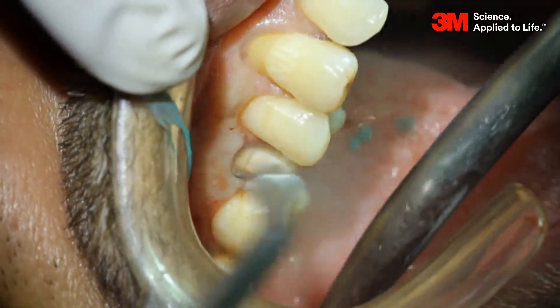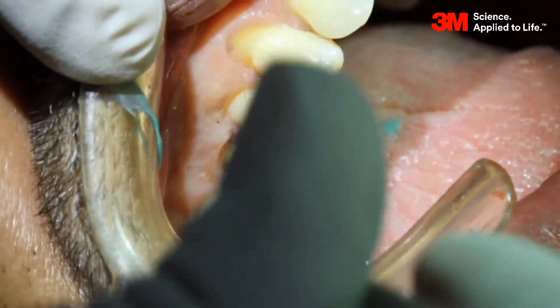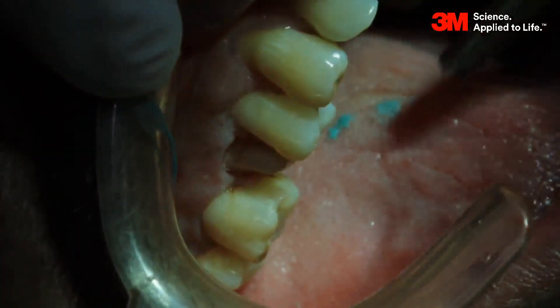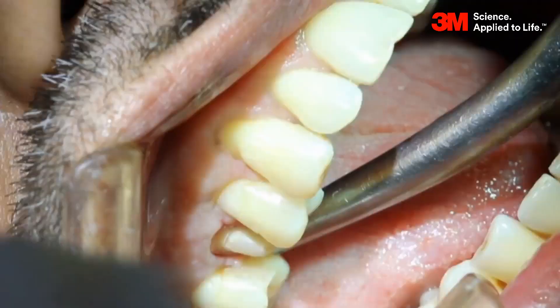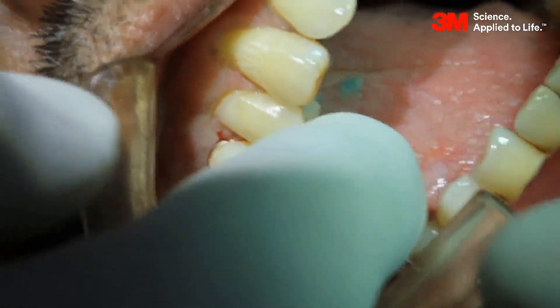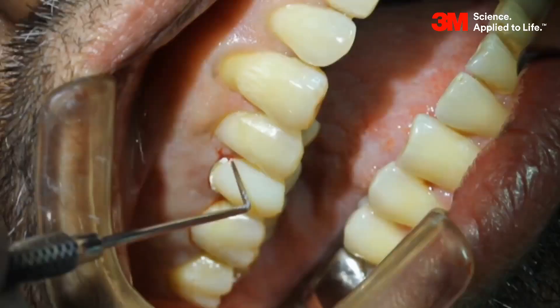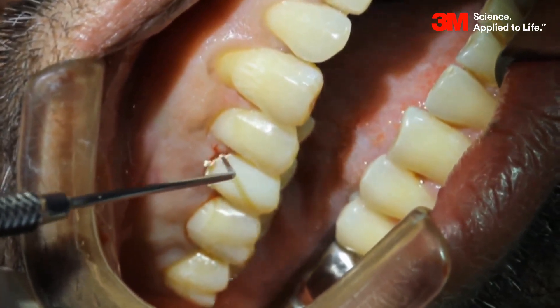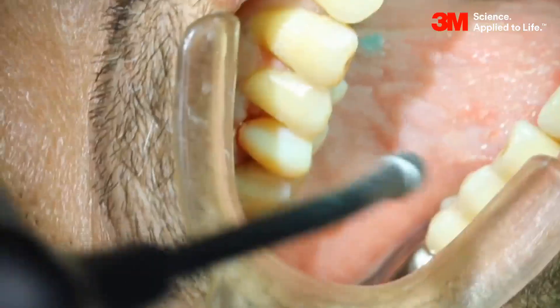Check for any voids or air bubbles. Isolate the area and cleanse it with a 3-way syringe and suction tip. Remove the cord packer from the gingiva. Cleanse the area completely using a 3-way syringe and suction tip and isolate the area. Place back the temporary crown and remove the excess cement. The impression is all set to be sent to the laboratory for further fabrication processes.